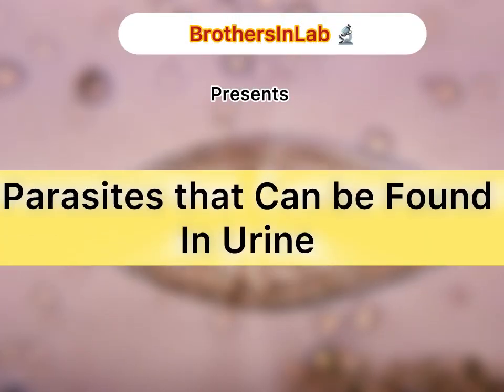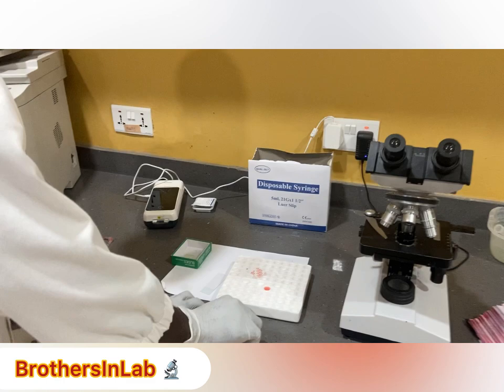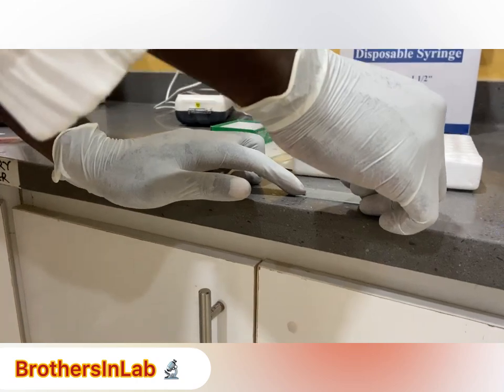Parasites that can be found in urine. The easiest technique for identification of these parasites is the wet mount. A direct wet mount can be used to observe the motility and the morphology of these parasites.